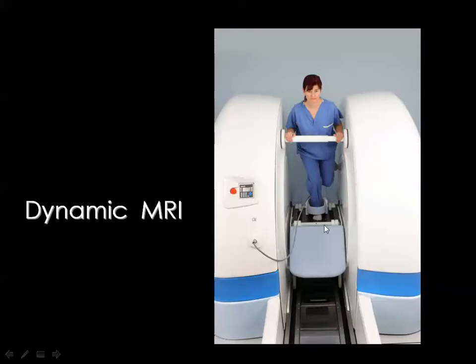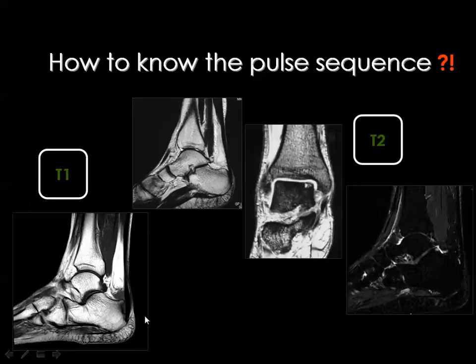And this is very important for the spine, the hip joints, the knee joint, as well as the ankle joint. And sometimes we are able to examine the patient while walking by moving this sheet underneath the foot of the patient.